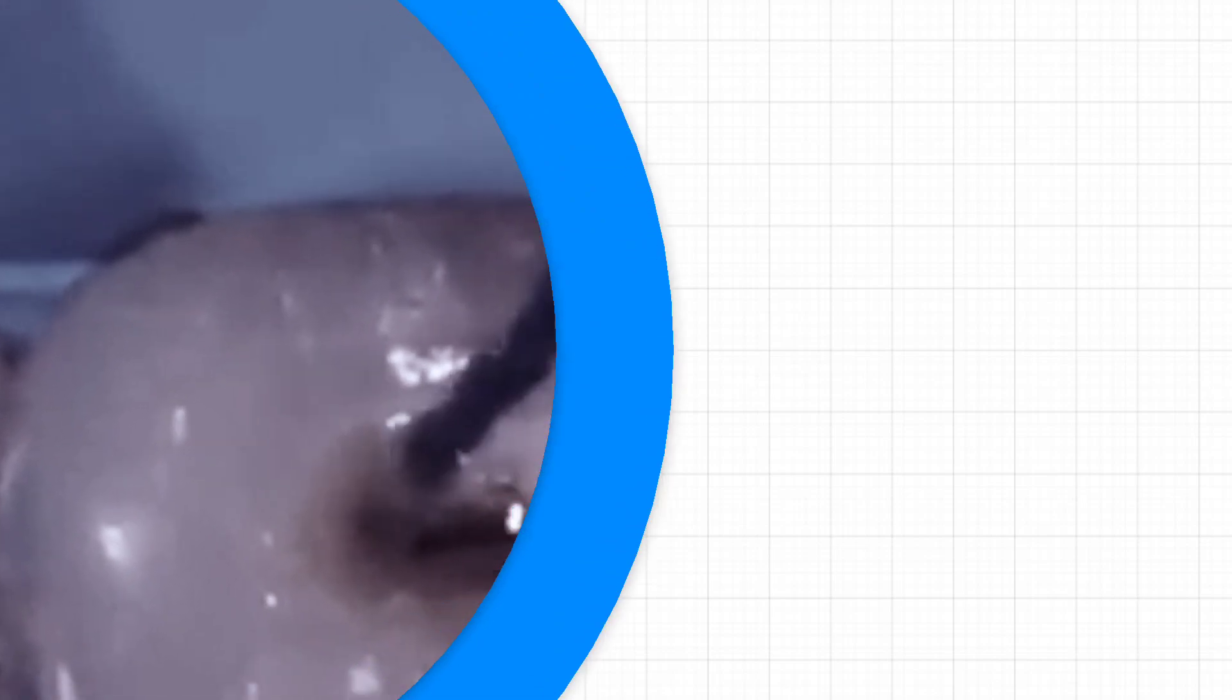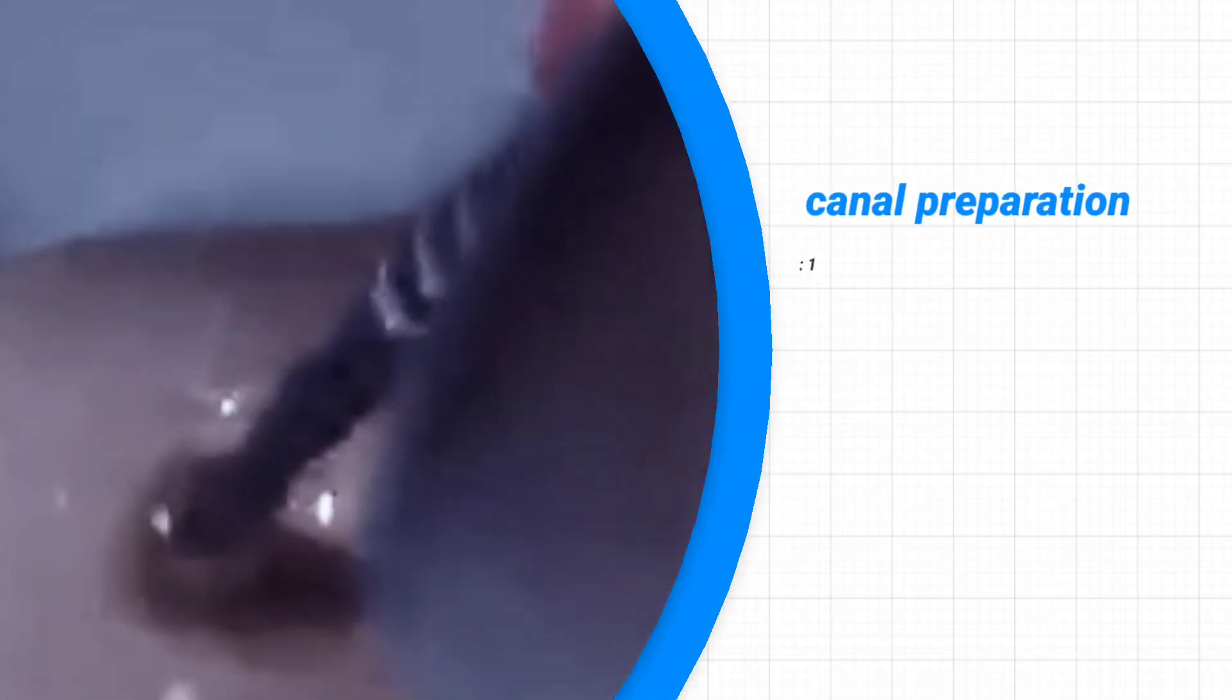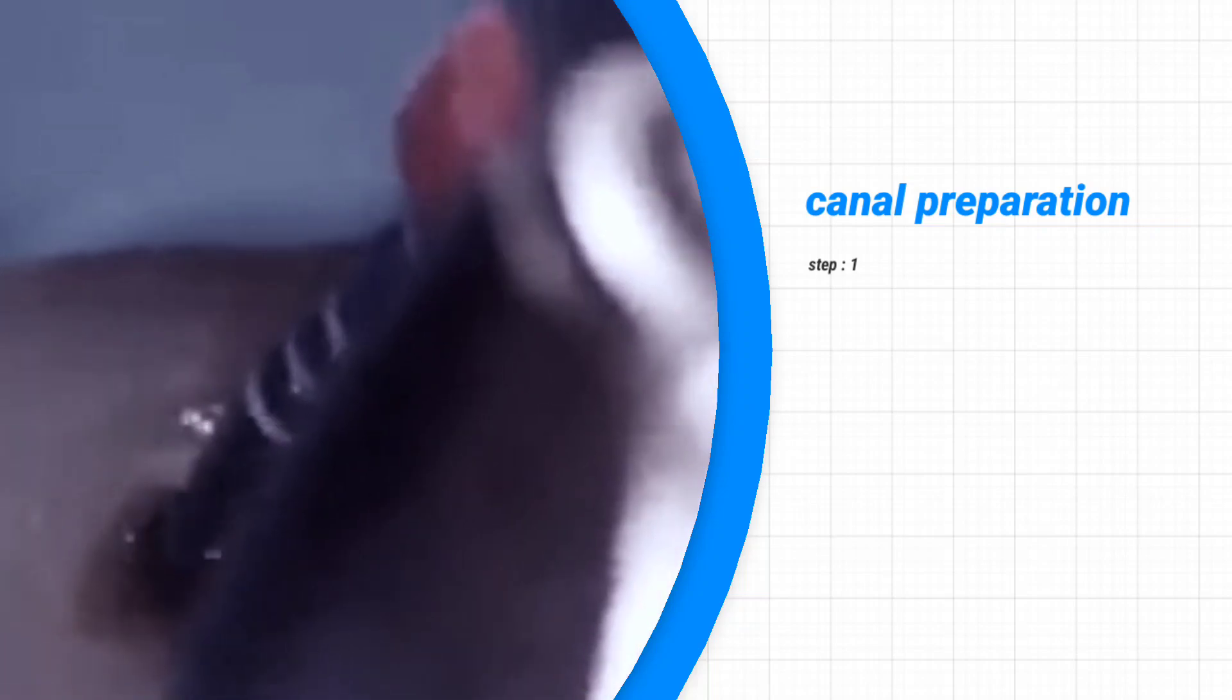The first step in the biomechanical preparation is preparing the root canal to the desired taper with the help of an endodontic file.